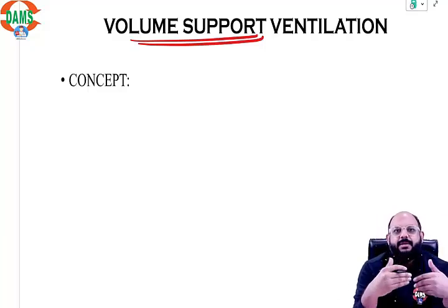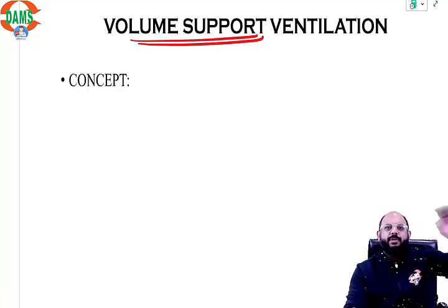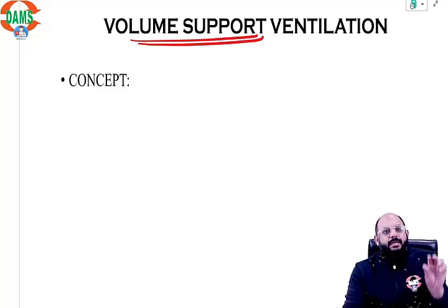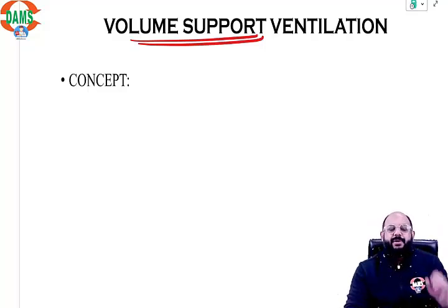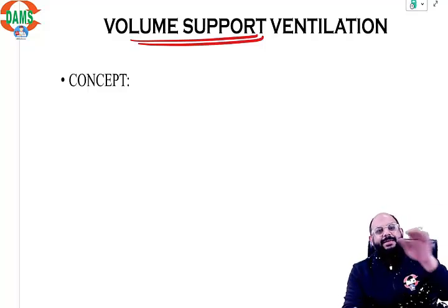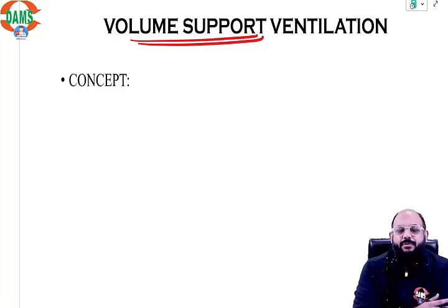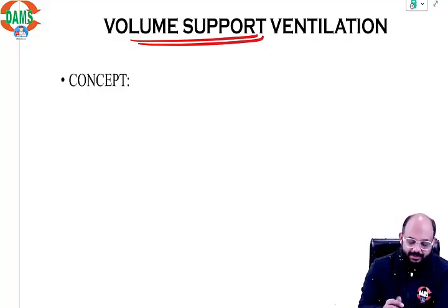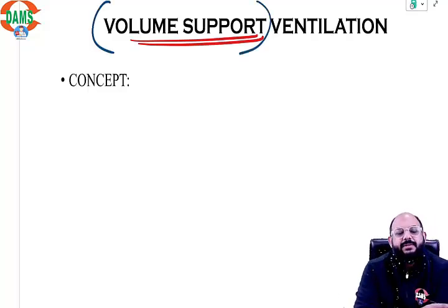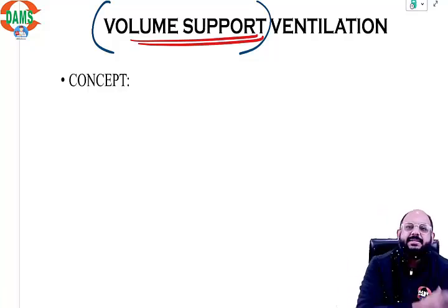Now as the patient keeps on improving its inspiratory pressure, the tidal volume will keep on going up because the ventilator will always add 5 centimeters of pressure. So if it was initially 7, the ventilator added 5, 12. Now it becomes 10 and the ventilator will add 5, it will become 15. So the volume will keep on increasing, again the risk of barotrauma. So now here what we have done is a volume support ventilation. We have preset a set tidal volume in a spontaneous mode, and now the ventilator only gives the pressure required to achieve that set tidal volume.